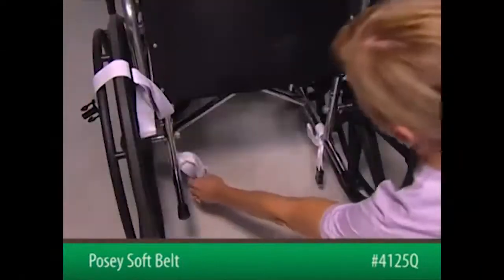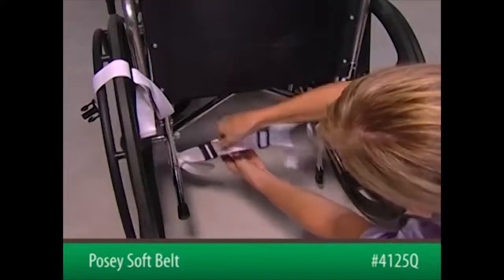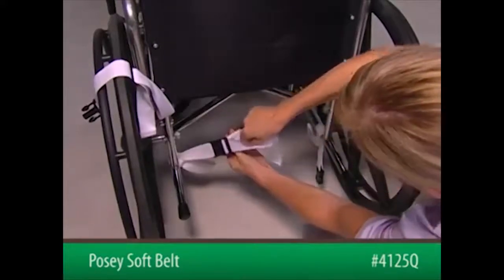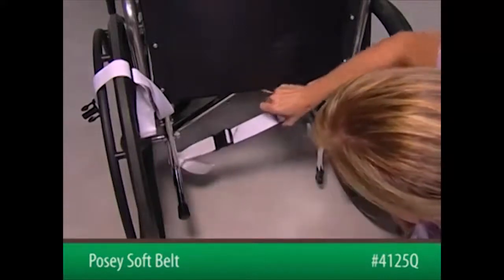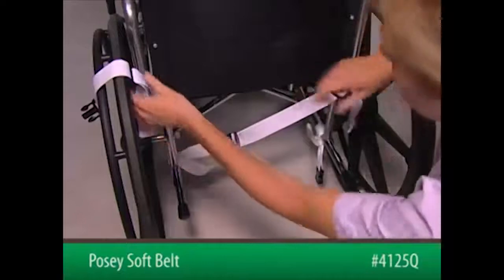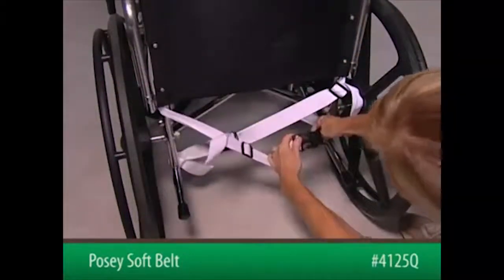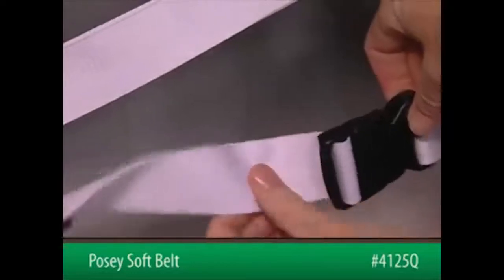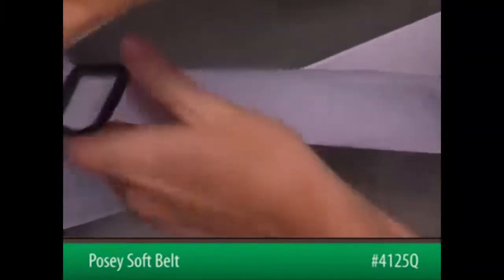Now, insert the male end of the connecting strap into the female end of the short strap on the opposite kick spur. Listen for a snapping sound. Adjust the tightness of the slide buckle by pulling the slide buckle away from the kick spur, and repeat the process with the other strap. Listen for a snapping sound. Pull firmly on the straps to ensure a good connection.